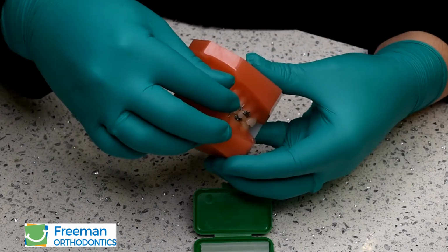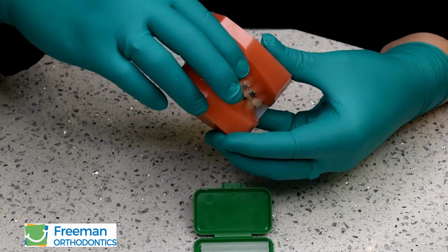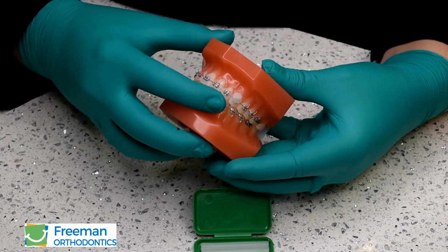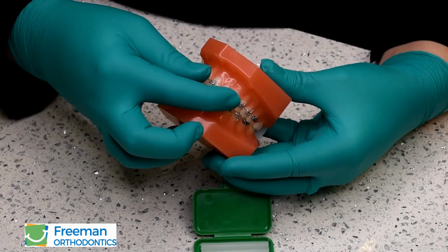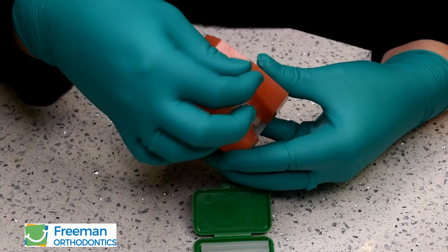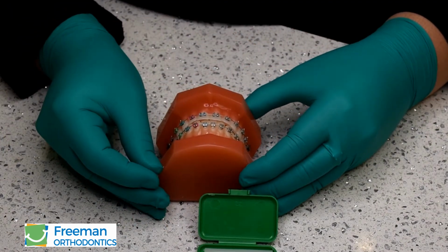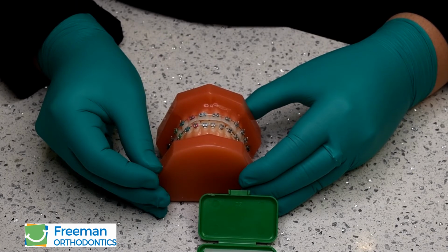The wax can stick to a bracket, a hook, or the wire. If the wax is not sticking, try drying the area off prior to placing the wax. Remember to remove the wax when eating or brushing and replace with some new wax. If you are ever in need of more wax, we are happy to provide you with some.